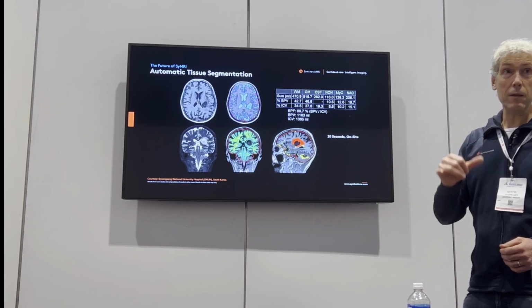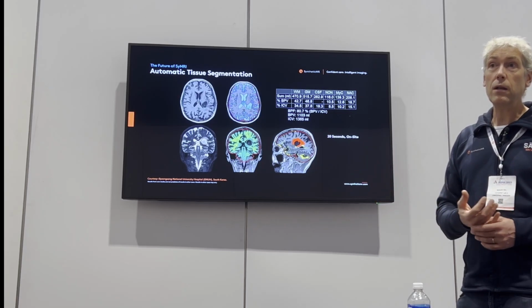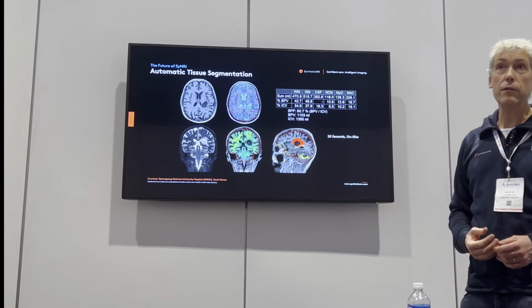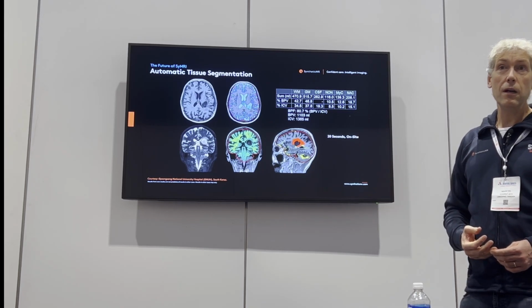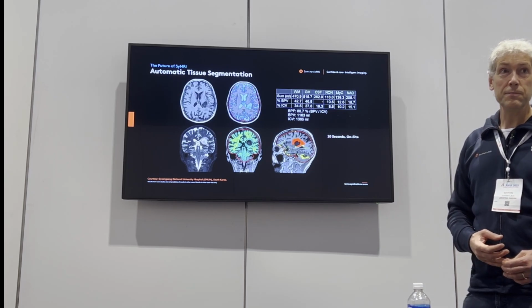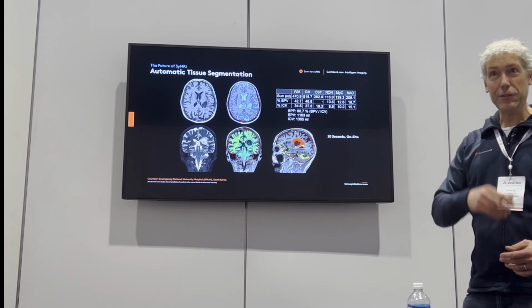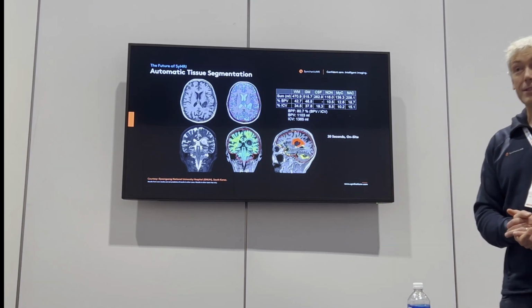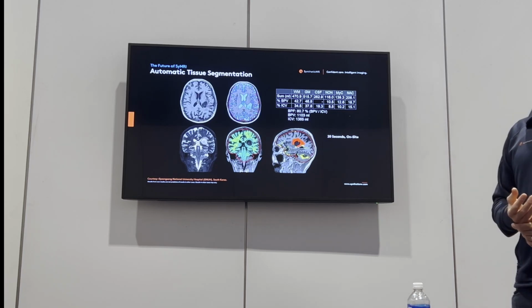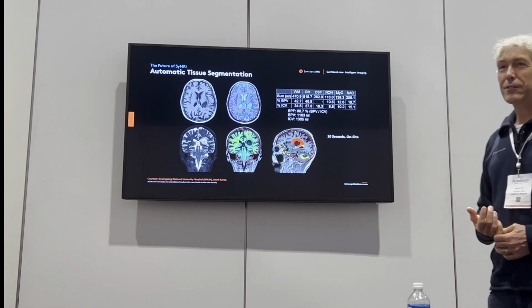There was a 3 year gap in between, and 3 years of normal atrophy of the brain is so much that it falls outside of our repeatability requirement. So it's that precise, right? 0.2% is about the average yearly decline of your brain after 40. So happy birthday, 0.2%. You don't want to think about it. After 40, sorry.